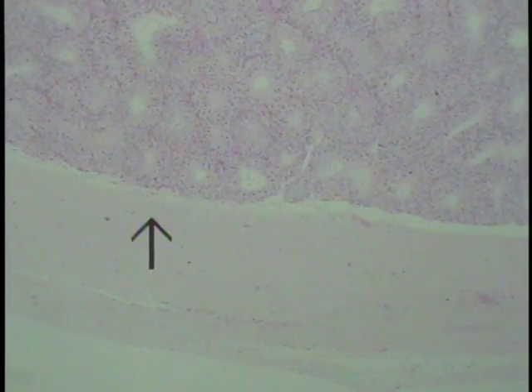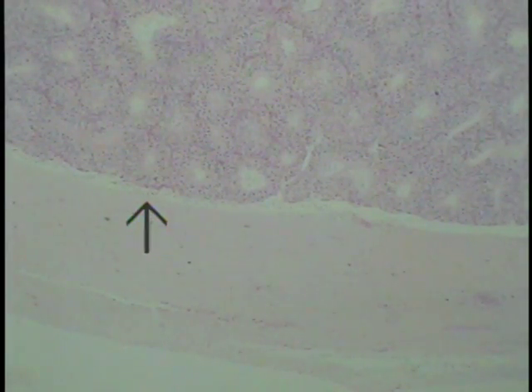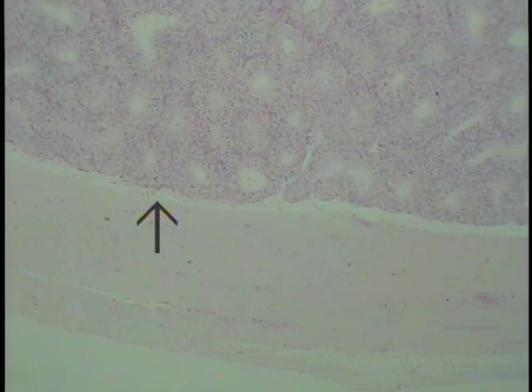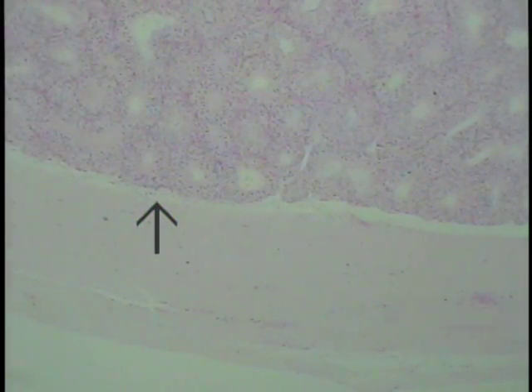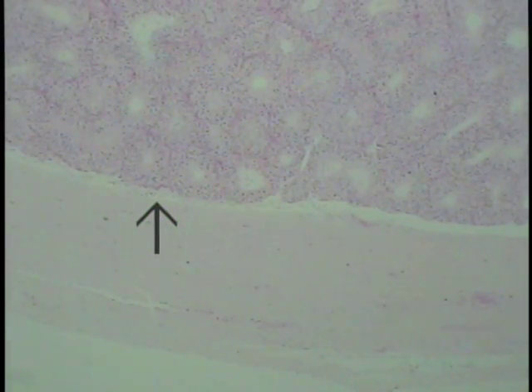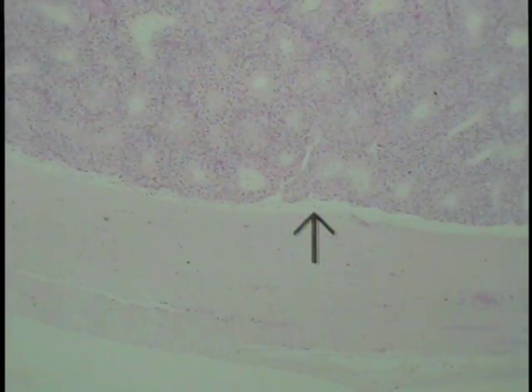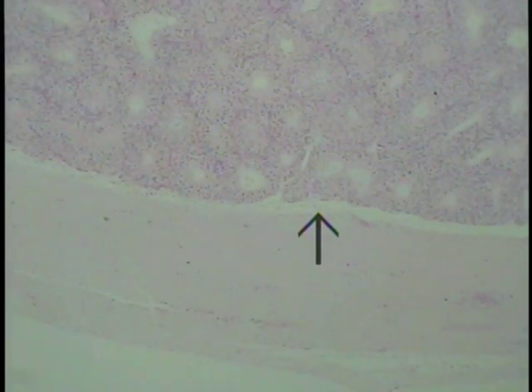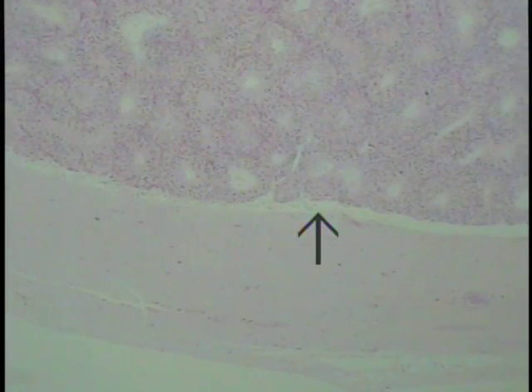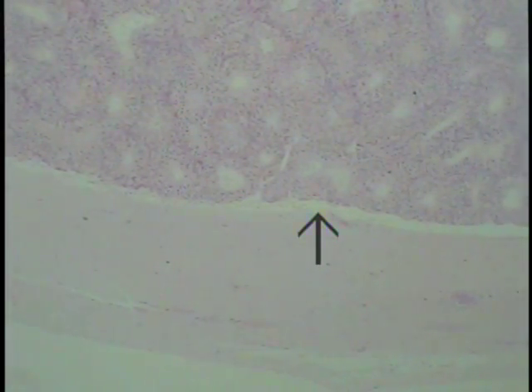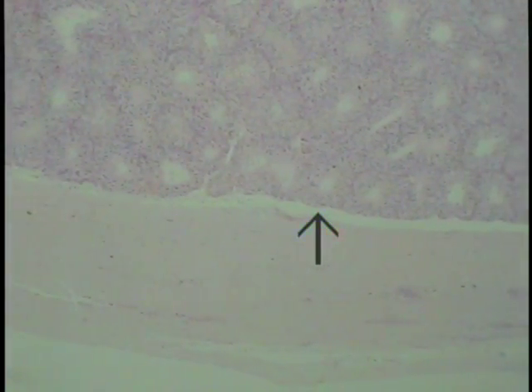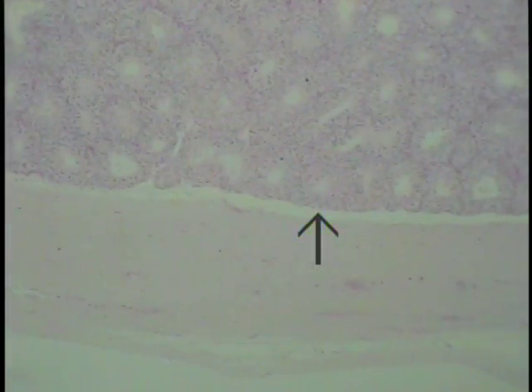This happens to be a primate testis, used here because of the better preservation of this particular specimen. Focusing on the arrow, this is where the tunica vasculosa would be, which resides just interior along the inner surface of the tunica albuginea.